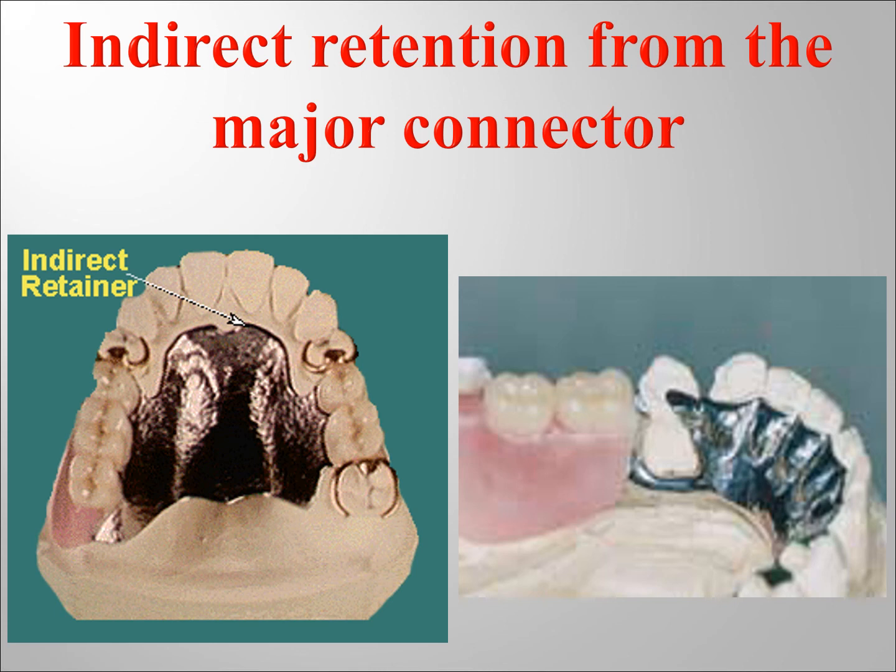resists the sinking of the anterior portion of the prosthesis. It resists the tipping of the distal extension away from the tissues and provides indirect retention. But you have to know that the major connector itself cannot be called an indirect retainer.